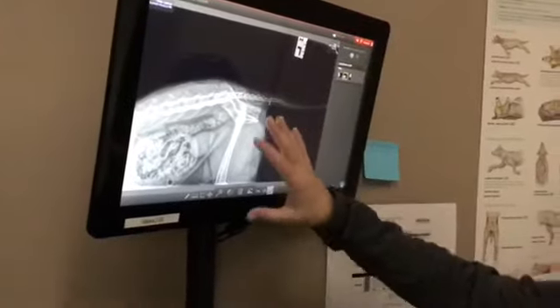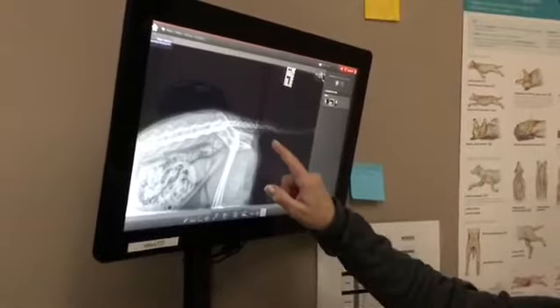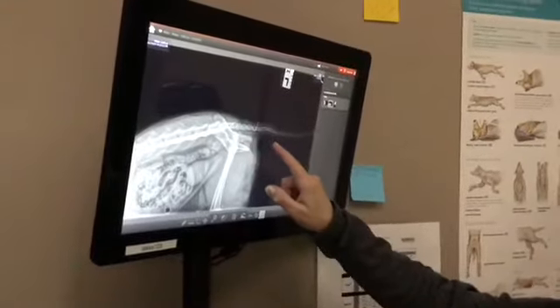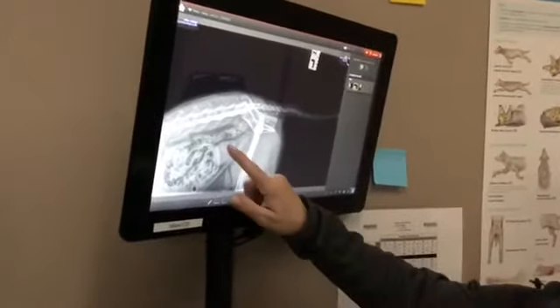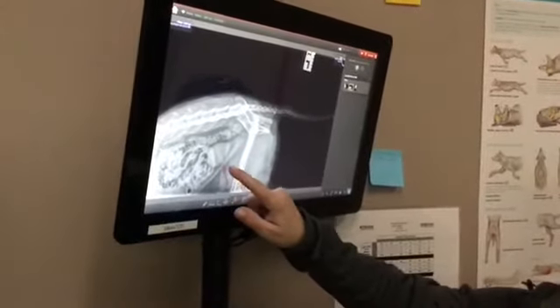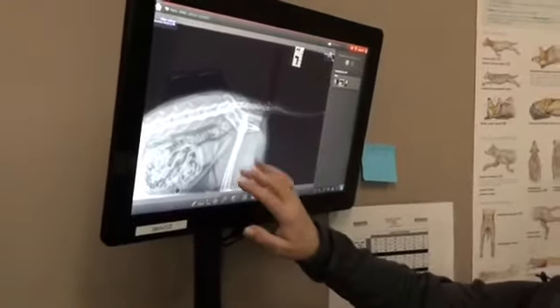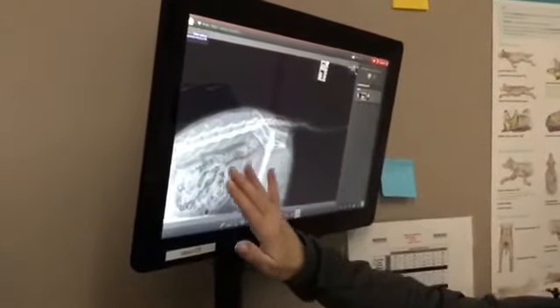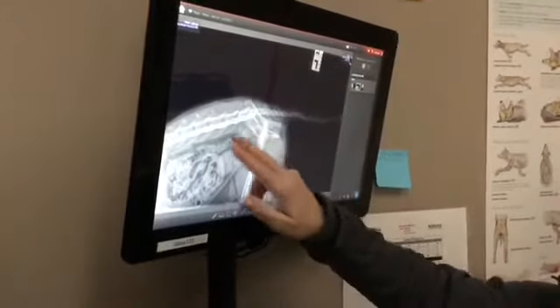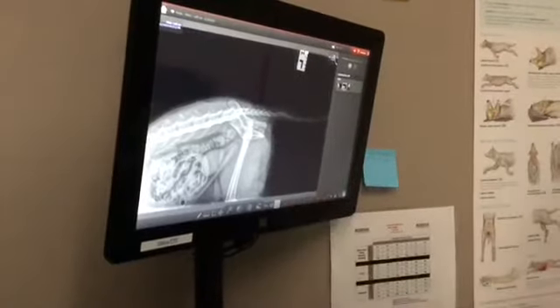So the reason it's just kind of his back end is because we were looking at the tail and we were looking for an injury there. You can see some other things on this radiograph. This right here, the circular shape, is his bladder. So that is an organ that we look at as well, the bladder and the intestinal tract. And like I said, this is his pelvis and spine. So we're looking at him laying down on his side.